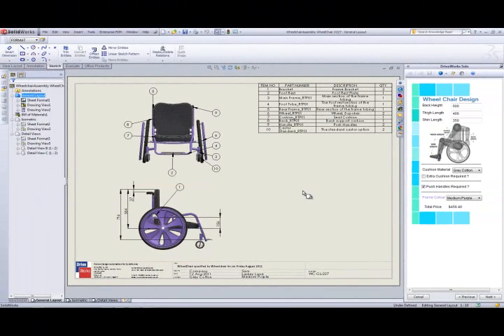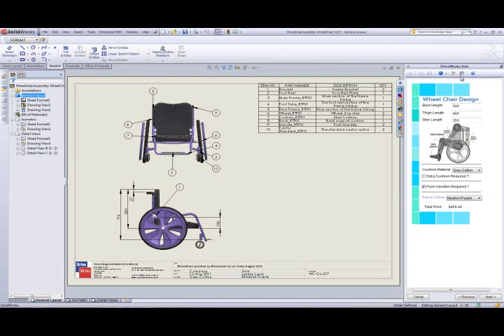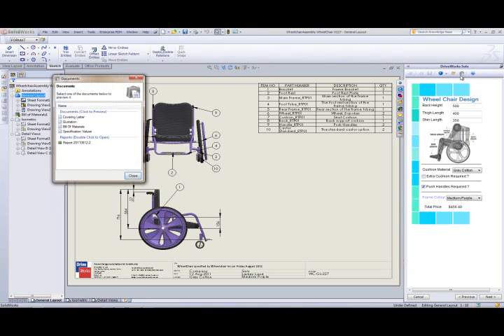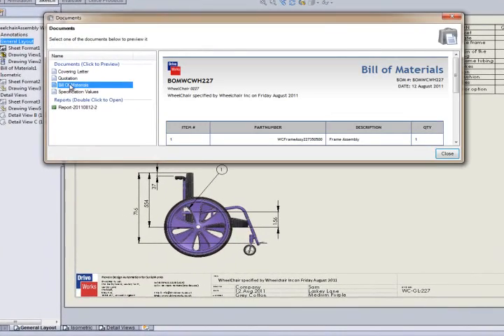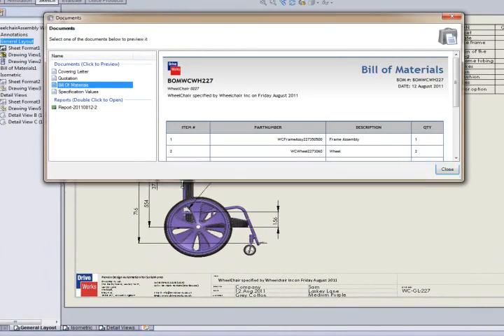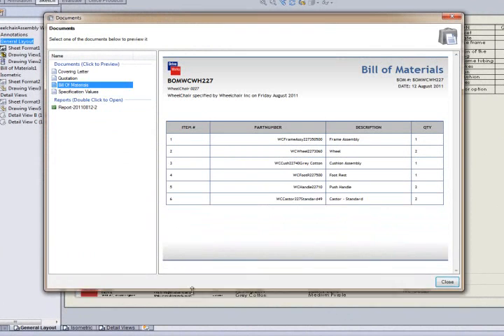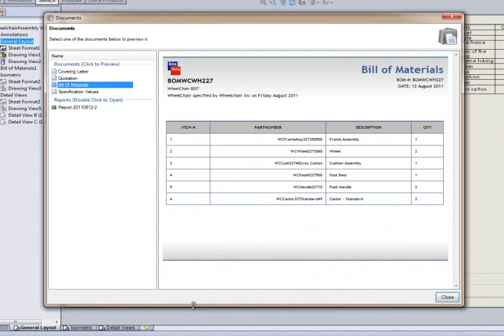As well as previewing the models and drawings, we can also view the documents created for this project. In this example, we have a covering letter, a quotation, and a bill of materials, which is a replica of the bill of materials on the drawing.